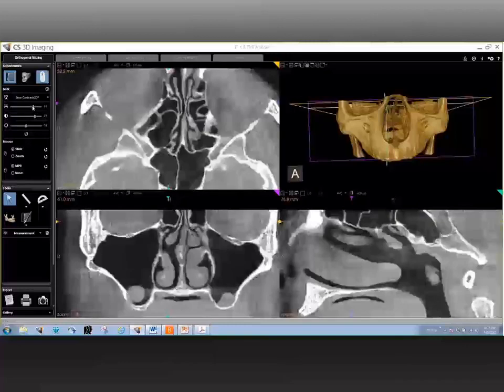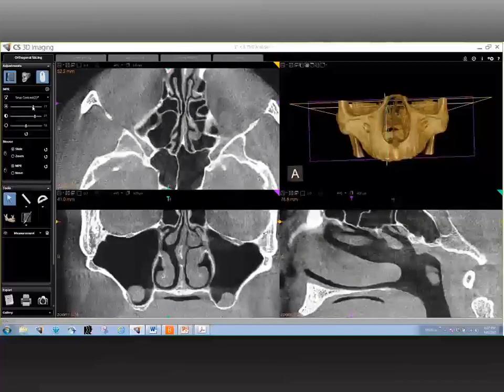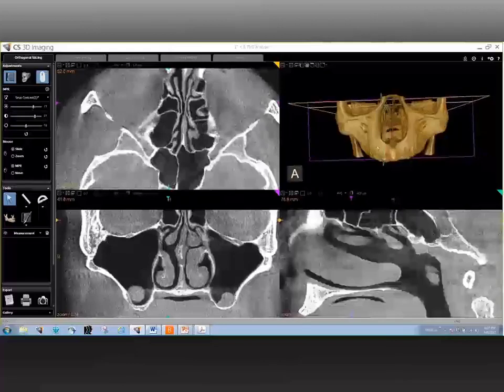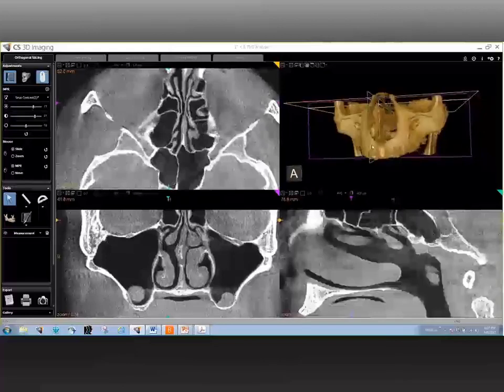Okay. So as long as we're on the subject of limitations of cone beam CT, I understand that caries detection, caries cannot be diagnosed either. Would you care to comment? That is very good. It is a good point. Doing a CBCT scan to visualize caries would certainly be overkill, and it is not advocated for that.